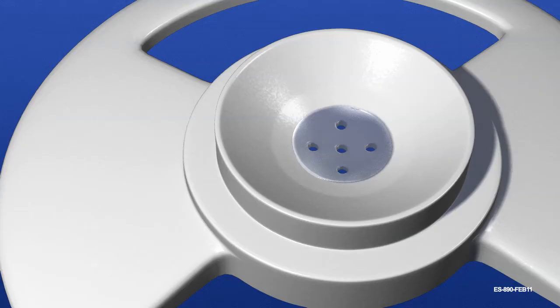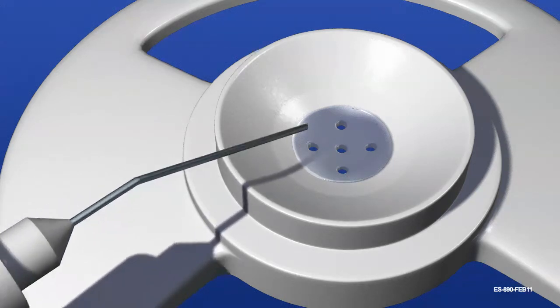Allograft tissue is refined by the surgeon to the preferred diameter. The Endosurter is designed to insert tissue measuring less than or equal to 8.5 millimeters in diameter and 175 microns in central thickness.